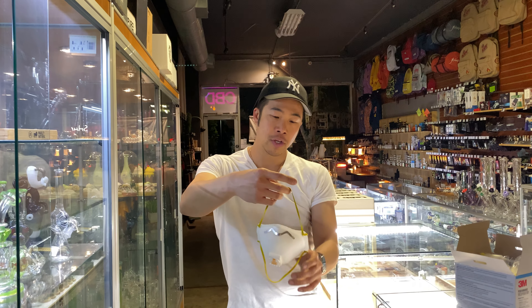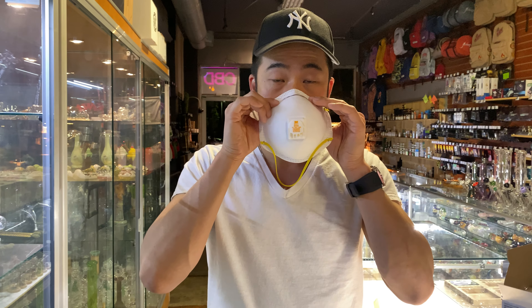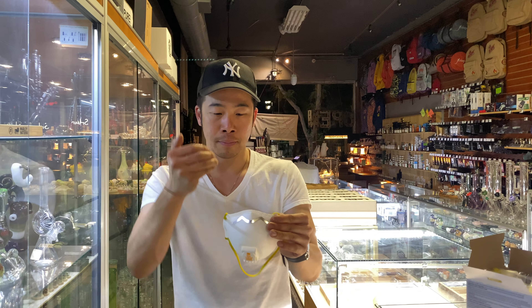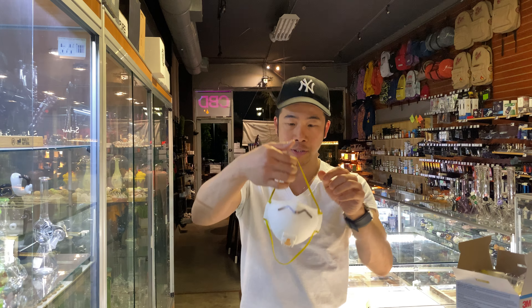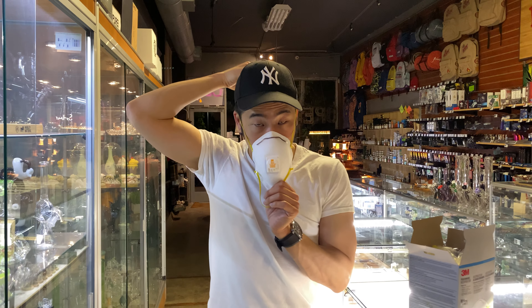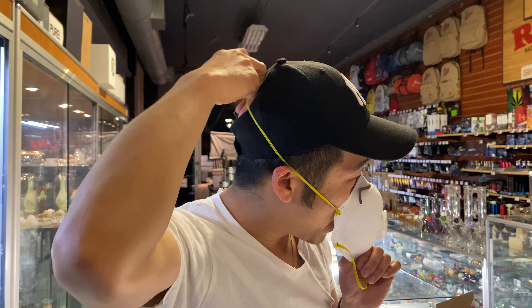I find it just as strong if I do this. The top part of the mask is the metal bridge that tucks against your nose so you can press it to mold to the shape of your nose and give it more surface coverage. So what I'm gonna do is only use the top part of the mask — I pull it over my head, leave just the top strap on at about a 45-degree angle, and let it sit just like that.